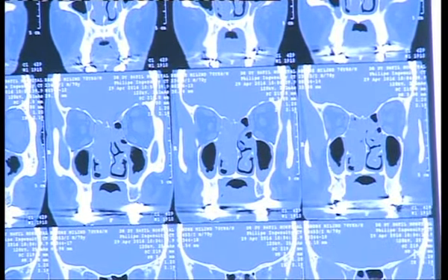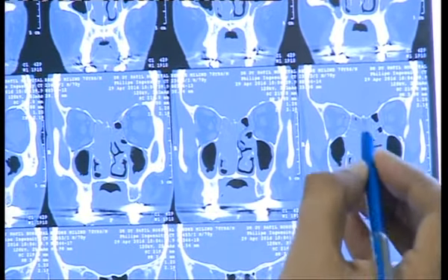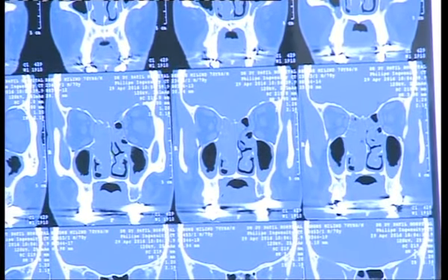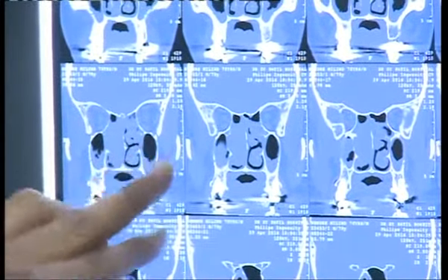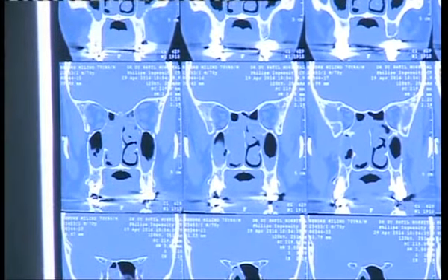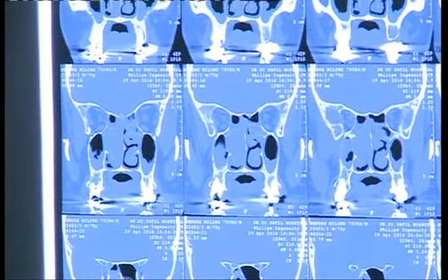now see there are certain changes. Unlike the anterior ethmoid, there is no cribriform now. As you go behind, the skull base roof is thicker. The orbit is becoming smaller, coning behind. And see the changes in the maxillary sinus. It's becoming more oval and smaller.